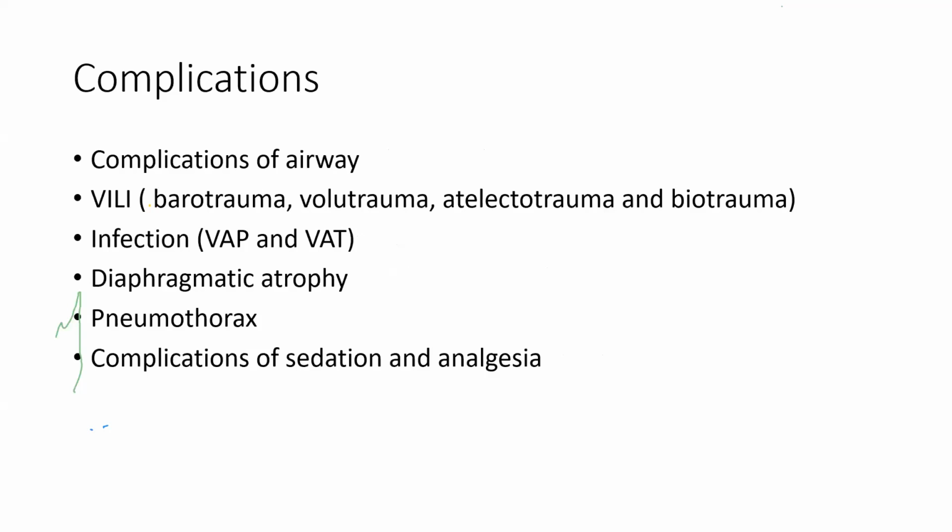The last section is the complications of mechanical ventilation. As we said, mechanical ventilation always carries some harm. All you can do is try to minimize it. So there are obviously complications that are related to the airway. Also, there are complications that are related to sedation. These are not strictly speaking complications of mechanical ventilation, but most of the time these are common associations.